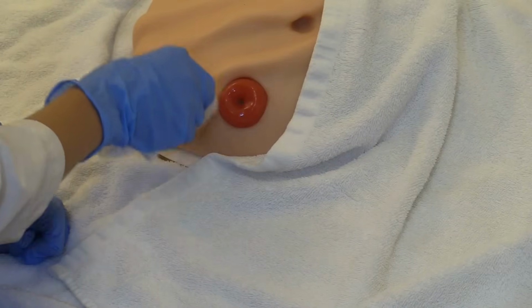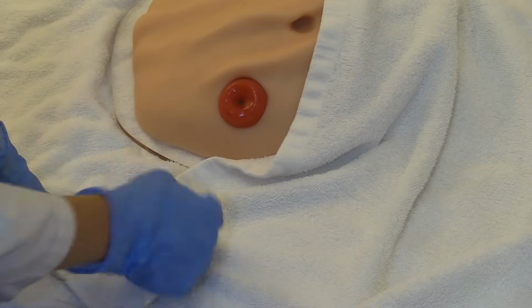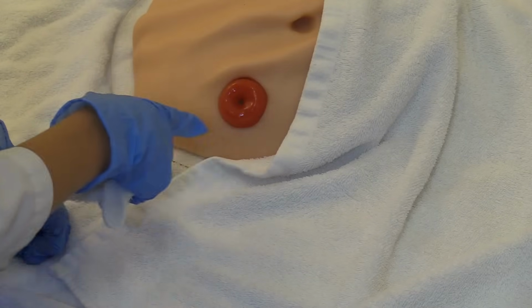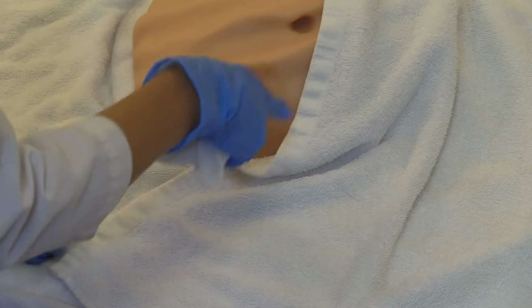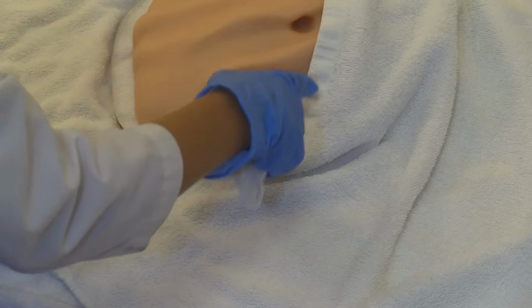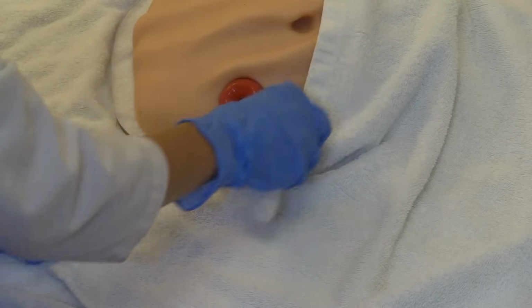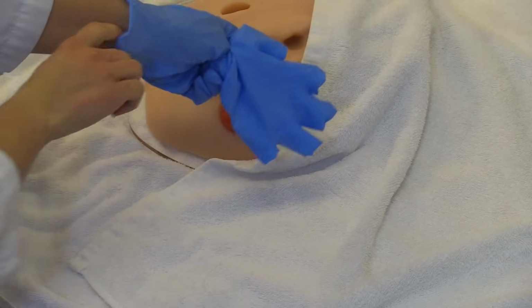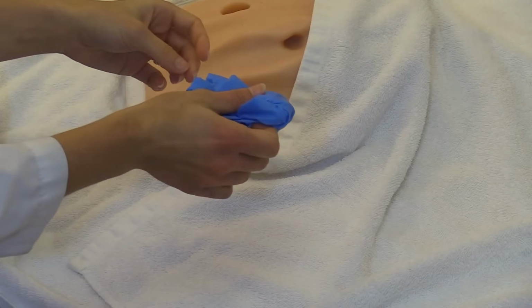to the skin. And if you have a patient who has a lot of hair on the abdomen, because you know hair grows back, you may want to trim the hair because number one, it'll stick better, and when you remove next pouch change, it's not going to wax their hair off, which can be very painful. So make sure you do that. Then discard your gloves and perform hand hygiene and put on a new pair of gloves.